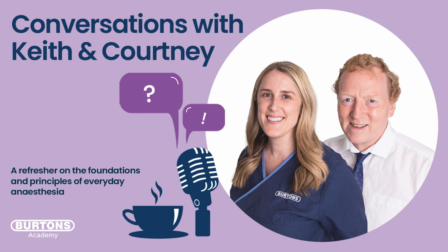Yeah. I think it sounds like a really big scary word, doesn't it? You think, denitrogenation, what is that? What am I doing? Believe it or not, if you're using a circle system, you're already removing the nitrogen from it by having that increase in fresh gas flow. So you're already doing it. But did you know there was actually a term for it?